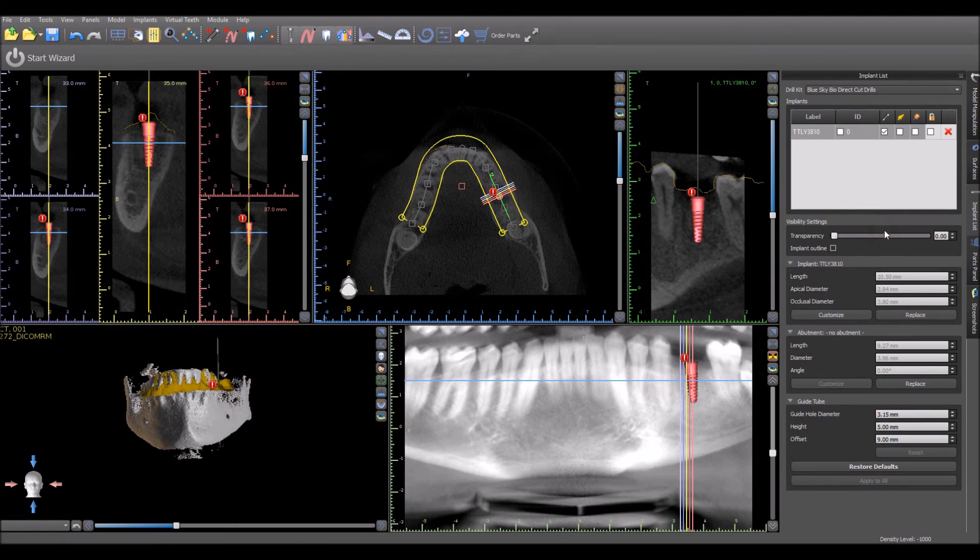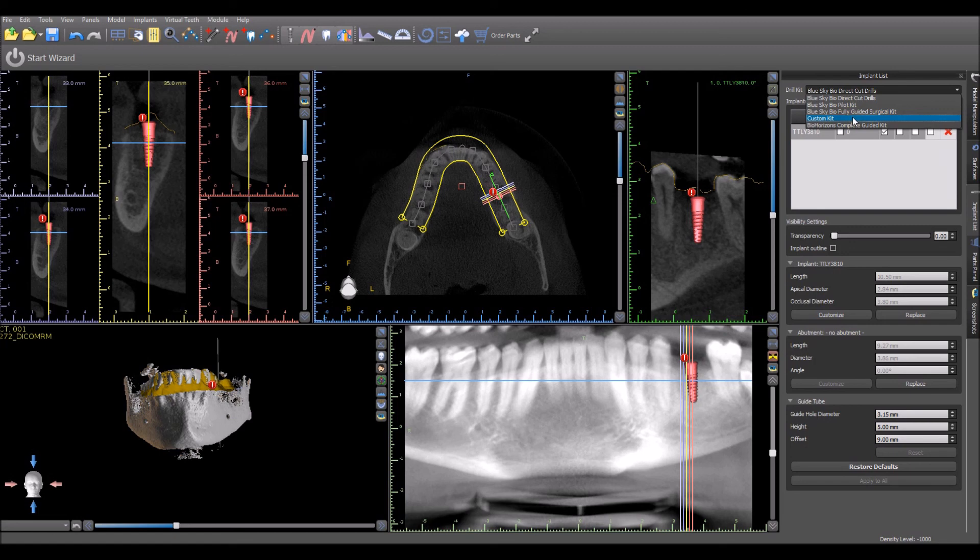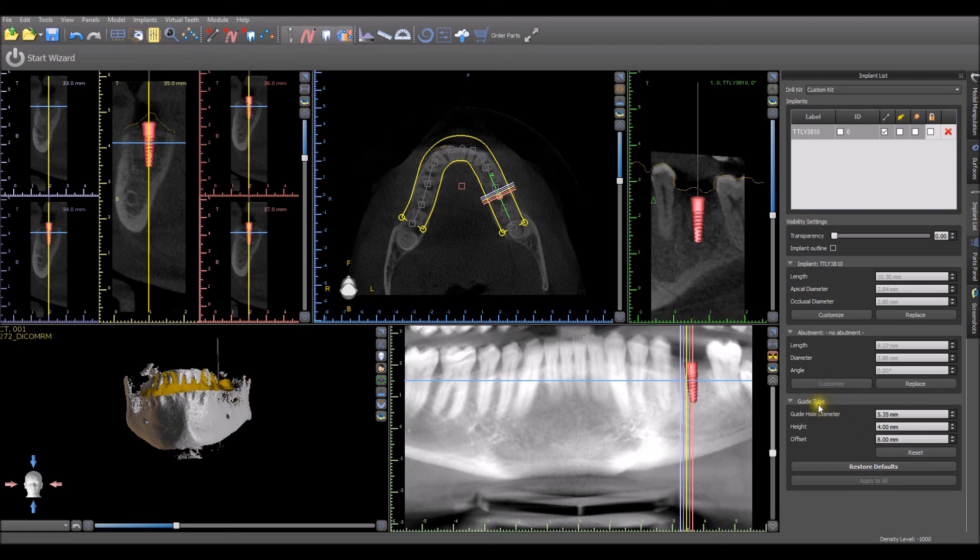If you would like the software to remember the custom guide tube settings that you have entered for the particular implant, then select custom kit from the drill kit drop down menu. Make the relevant changes to the guide tube settings. The software will automatically store and remember the settings entered for the particular implant.